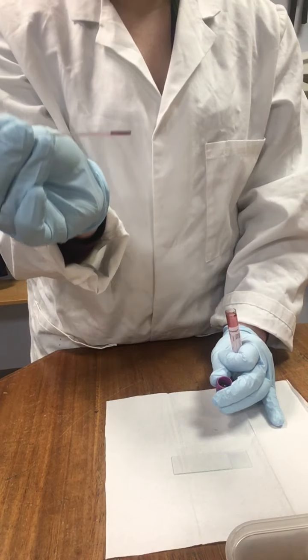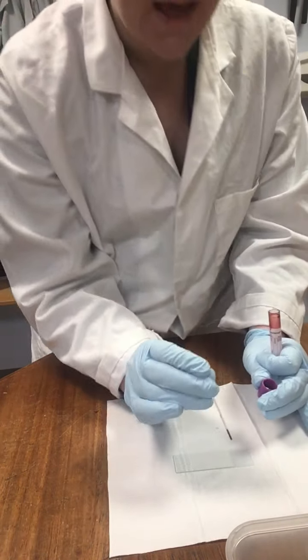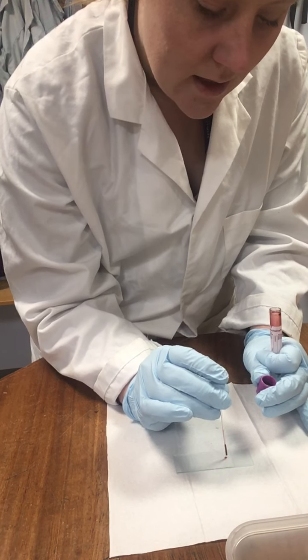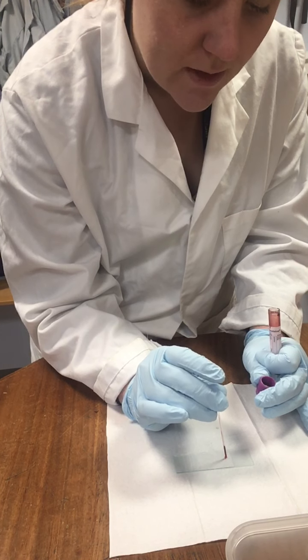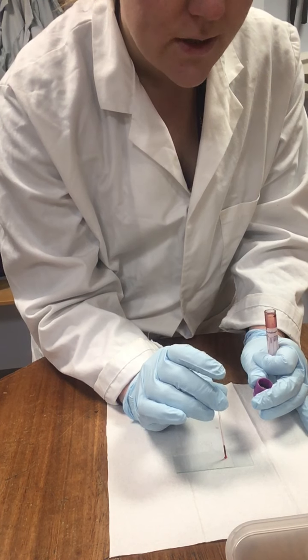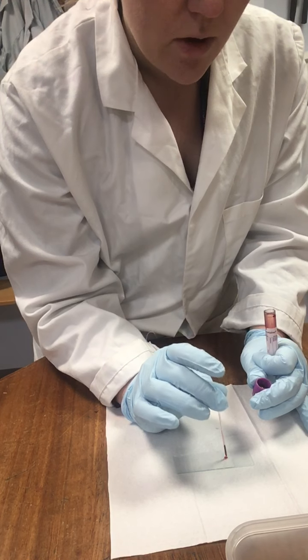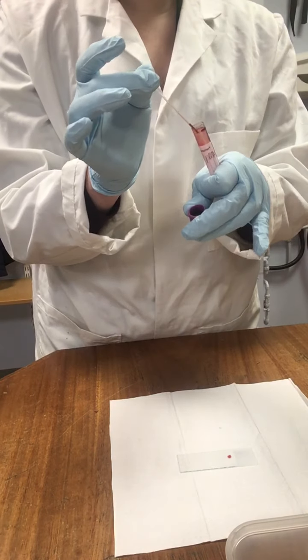So using the hand that you have the capillary tube in, we're just going to place a spot of blood at the end of our slide, and it's always recommended that you do this at the point of the frosting if you've got frosting, just because it allows for us to have an easy space to write on without interfering with the slide. So a reasonable amount of blood on the end. We're not aiming for a mountain of blood, but we do want to have enough for our sample.